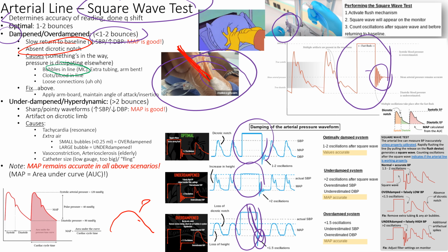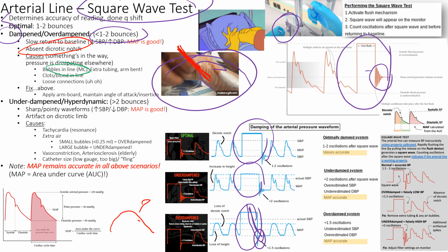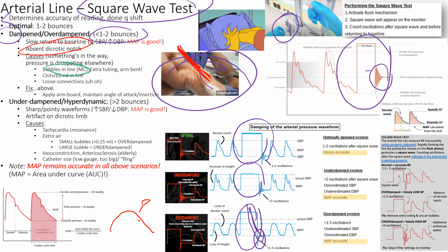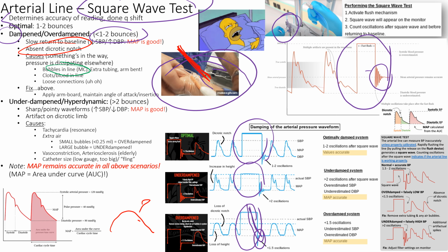And then there could be clots in the line. Somebody didn't flush it adequately. So we want to make sure that's why it's always flushing. Your bag is inflated, right? Your bag's deflated like this, where I don't see the green. Then that means it's putting less pressure on the system, right? So it's putting like 120, and their blood pressure is 110. There's not a lot of difference there, right? So you're going to be seeing a dampened waveform.